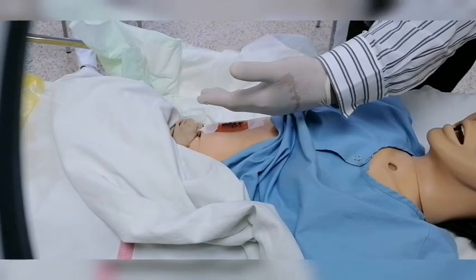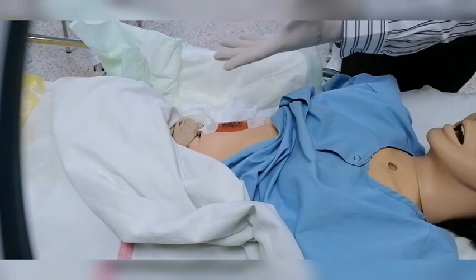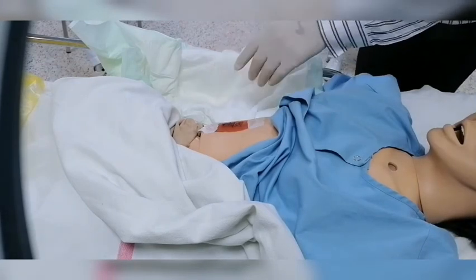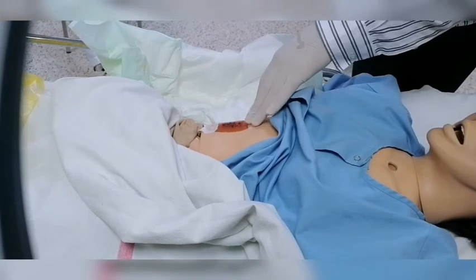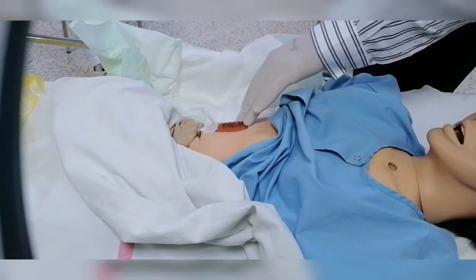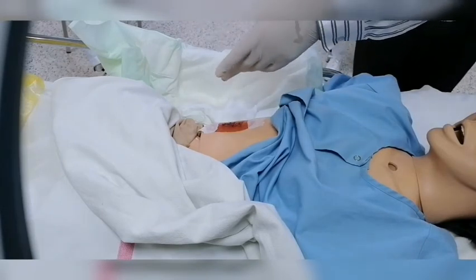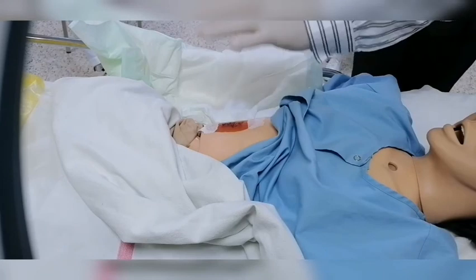Also, if there is a smell coming from that secretion, is there any abnormal thing around this wound? If there is a drainage, what's the type of the secretion which is coming from the drain? So all of those things I have to assess. I will assess if there is any secretion. I will assess if there is redness, if there is any sign of inflammation: redness, hotness, tenderness, pain. So all of those signs I have to check before doing the dressing. And this also has to be reported later.